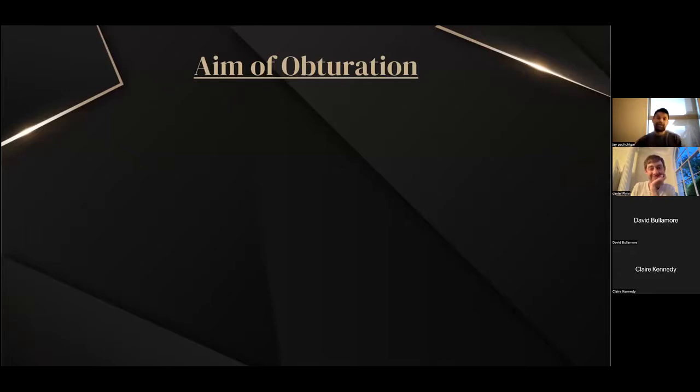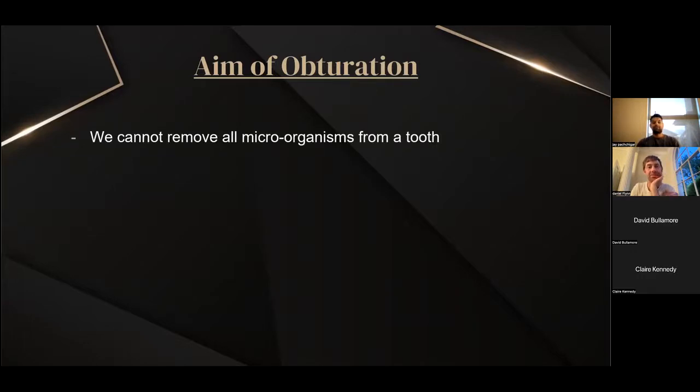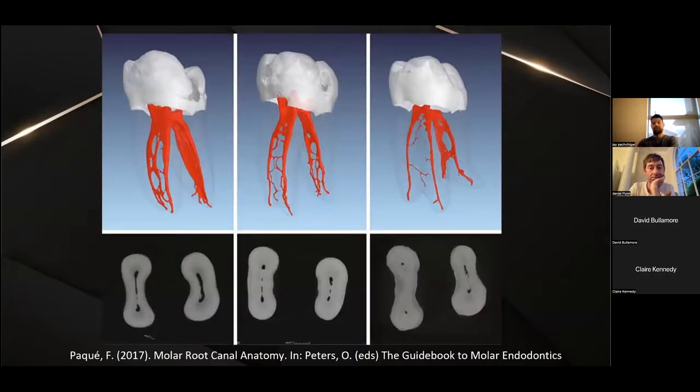So first of all, the aim of obturation. Why do we obturate in the first place? We've known for quite a long time that we can't remove all the microorganisms from a tooth, and pictures like this really explain why. This is a micro CT scan of a few different teeth, taken at different ages. On the right hand side, I think this lady was about 70 years old. So even in these elderly people, where you do often get sclerosed canals, there's sometimes a lot of difficult anatomy to fill.